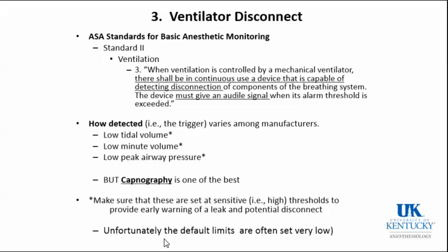Some of you have noticed that many of our machines now, the ventilators, they automatically set these alarms. And if you change the tidal volume intentionally to cause the pressure to go up or the pressure to go down, you may get a false alarm because the pressure that it's selected to alarm at has changed.